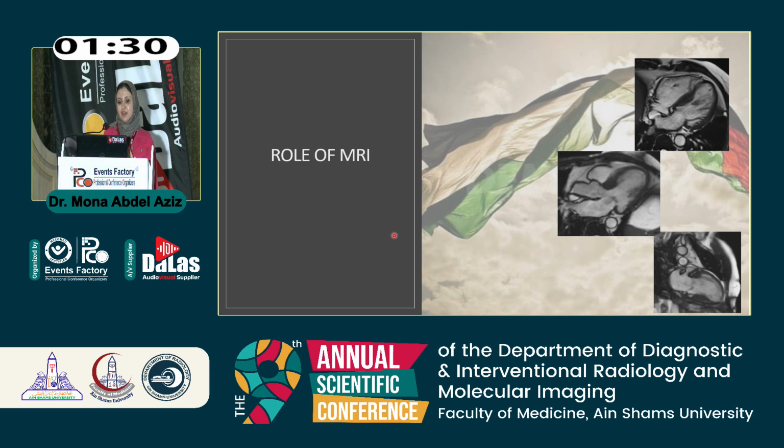So, what is the role of MRI in detection of the HCM, confirming the diagnosis, detection of associations and complications, and helping in management? We first will talk about the protocol taken. We will take our regular Cine images: Cine 4-chamber view, Cine 3-chamber, and Cine 2-chamber view.